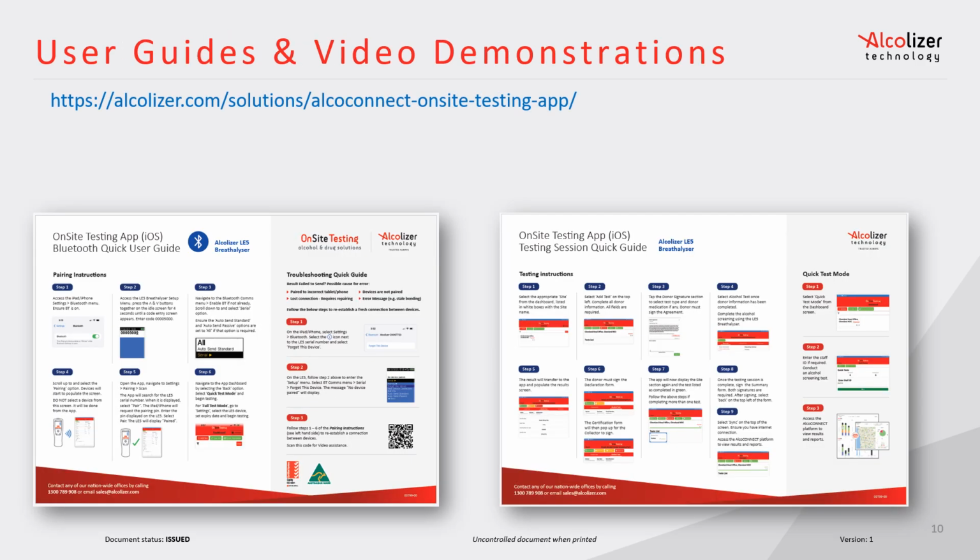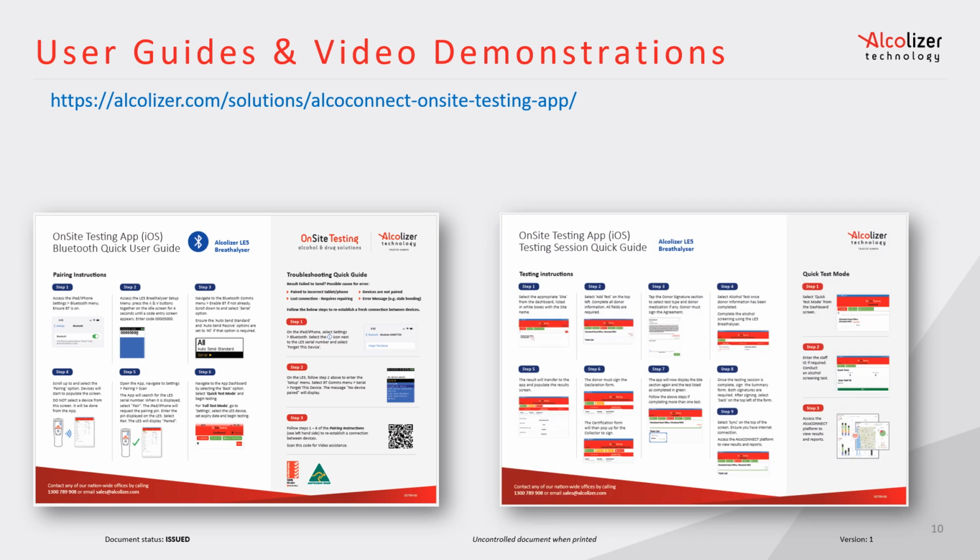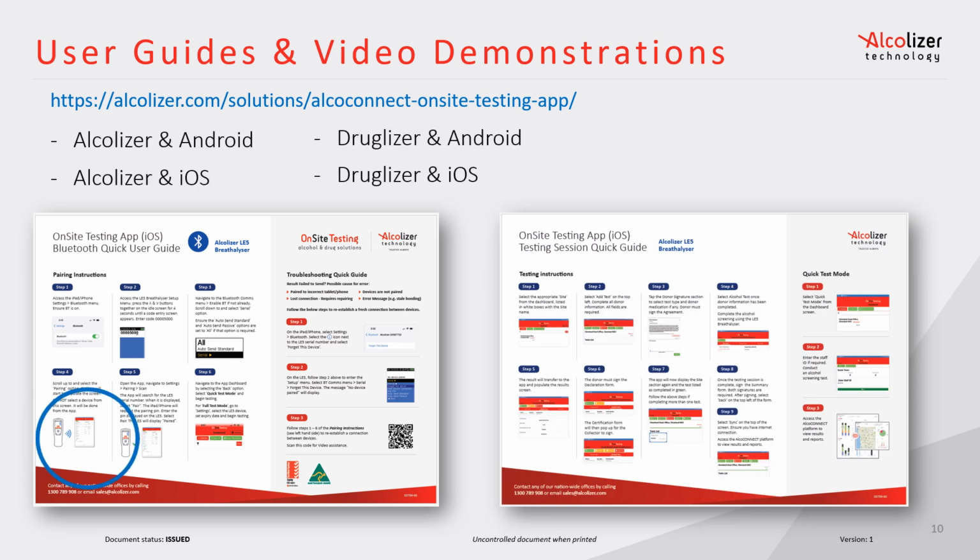Visit Alcolizer's website to download informative user guides for pairing your devices and testing instructions. The user guides are available in 4 combinations. Scan the QR code on the Alcolizer user guides to view a video demonstration on pairing and syncing test results.